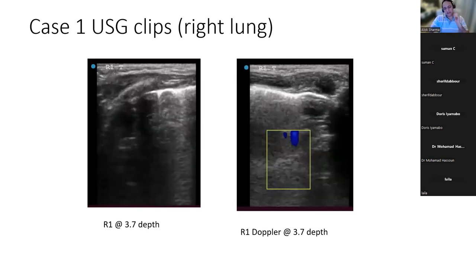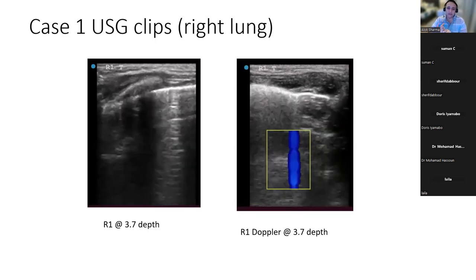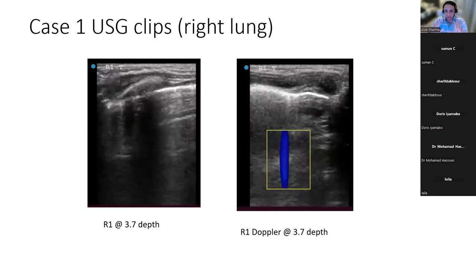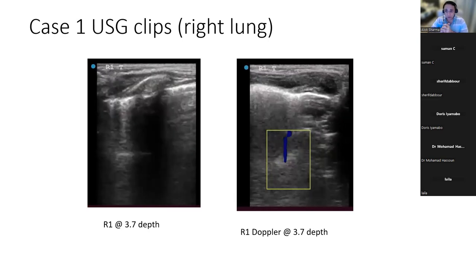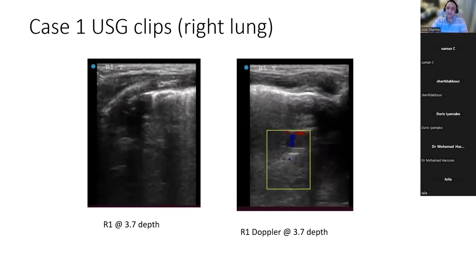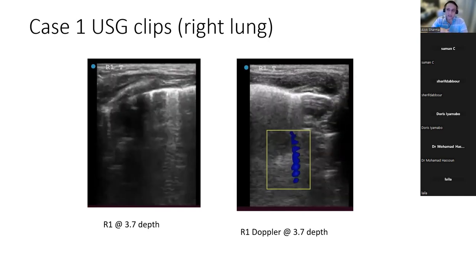Going forwards, what we'd like to do is see image optimization. In particular, when we start doing the peer review in the consolidation phase, it's about you being able to demonstrate whether we can actually improve. And just for all of you to be aware, sometimes probes are old and it's difficult, so don't kill yourselves over it. But I'm not doing my job if I'm not helping to see if we can get this better. For me, this is a beautiful scan, and it's a really good example of how you don't need a chest x-ray.